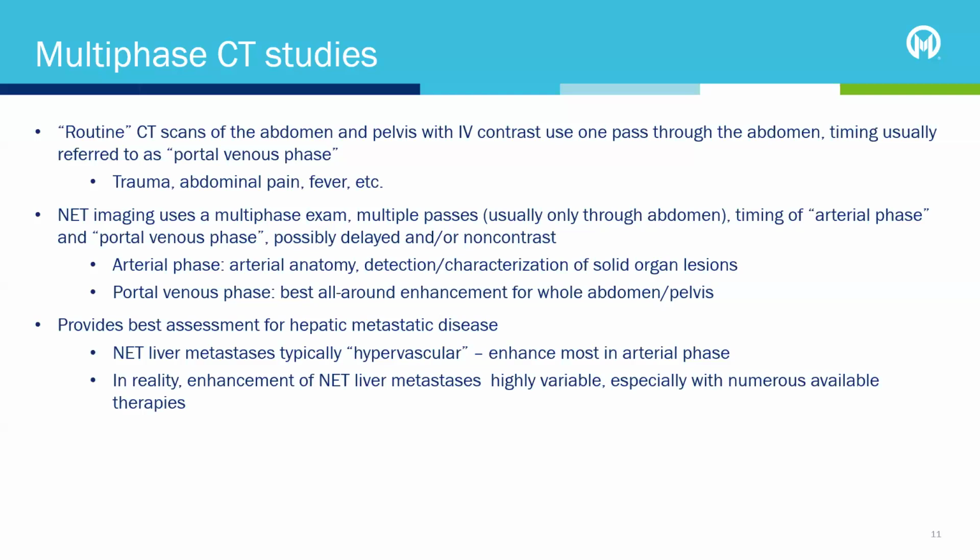But portal venous phase is used because it provides the best all-around enhancement for all the structures of the abdomen and pelvis. And so that's why we use it for what we would call routine imaging. So just you're in the emergency room, fever, car wreck, that would be the timing.